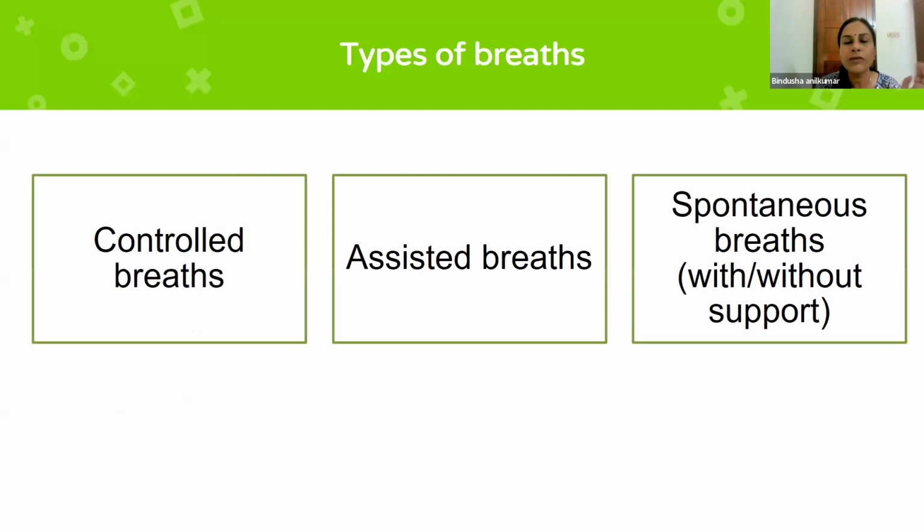Before we go into the variables proper, I want to make you aware that whenever you are connecting the patient to a ventilator, there are three types of breath that the patient can get. The first one is a controlled breath.